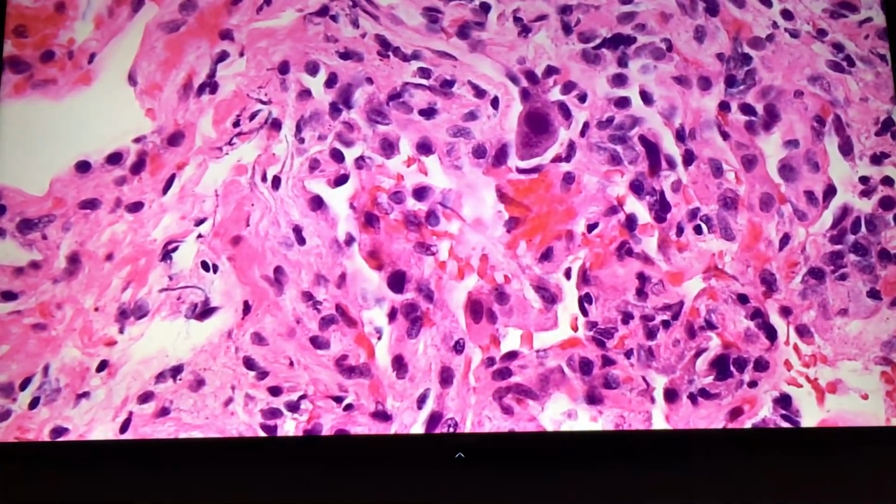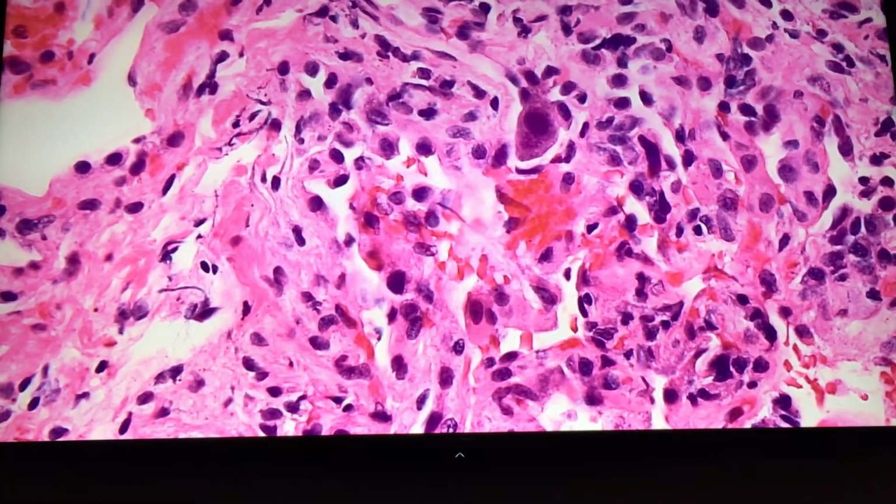So the important message I want to tell you is when the patient is severely immunocompromised enough to have PCP, look for a second organism. I have seen in a cytology case 3 organisms in the same slide: Histo, PCP, CMV in the same slide. So that's the message I want to give you, that severely immunocompromised people can have more than one infection, so never forget that. You'll be very happy that you made a great diagnosis of PCP, step back and say, go back to the slide again.